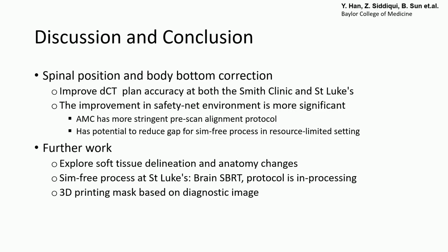And for our simulation-free process at Baylor St. Luke's, we submitted a protocol for brain SBRT, and we hope we can treat soon. Another thing is that the simulation image has the immobilization device. So our group is working on using 3D printing technology to make the immobilization device, like a mask, based on the diagnostic image. Thank you very much.